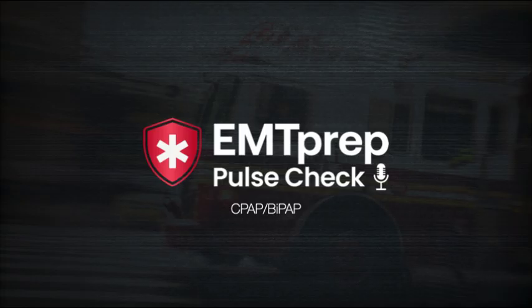If you have your end-tidal CO2 waveform capnography cannula on, we can leave it on during the application of CPAP, as this will not affect the mask seal and gives you the ability to consistently monitor waveform capnography. From there, we may administer an inline DuoNeb in conjunction with CPAP as long as it's indicated, and we'll reevaluate frequently for desired effects: SpO2 above 94%, work of breathing improved, lung sounds improved.